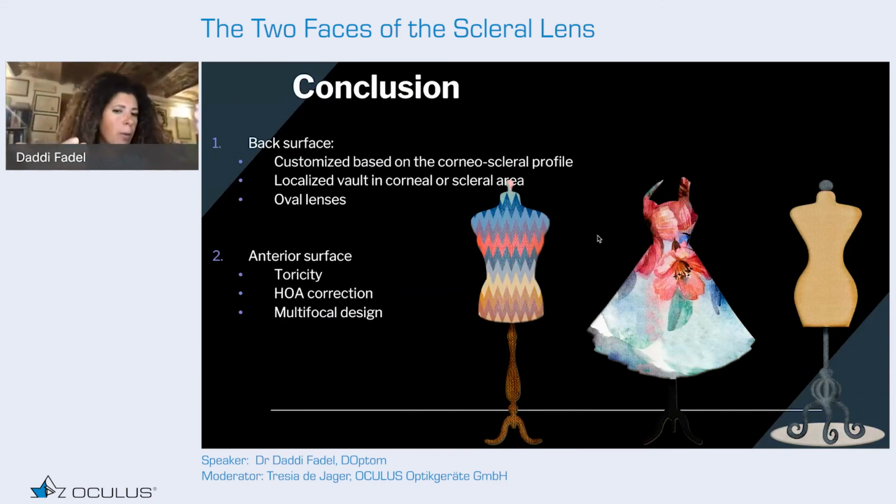Different techniques are available to help with this. Costs may represent a limit, but you also have to consider how much time you will spend optimizing the lens, how much time you will consume to get the final lens, how many lenses you need to reorder to get to the final lens, and how much money you will spend in reordering the lenses.